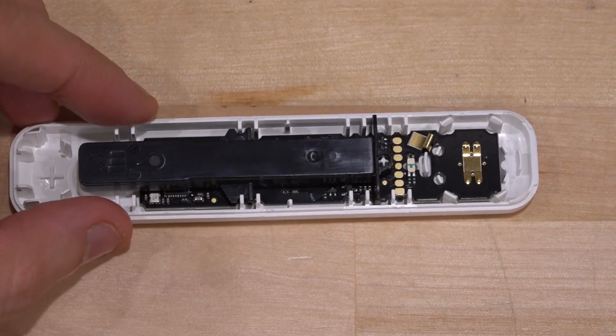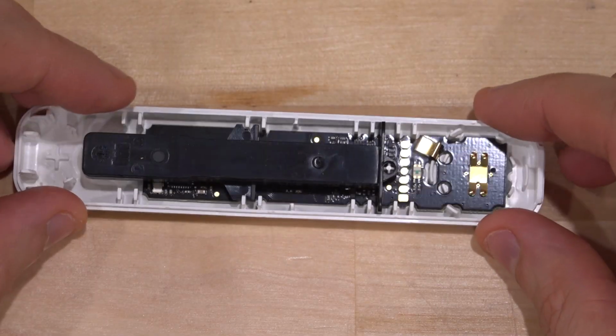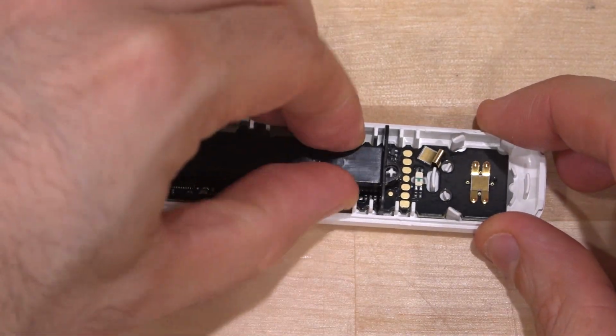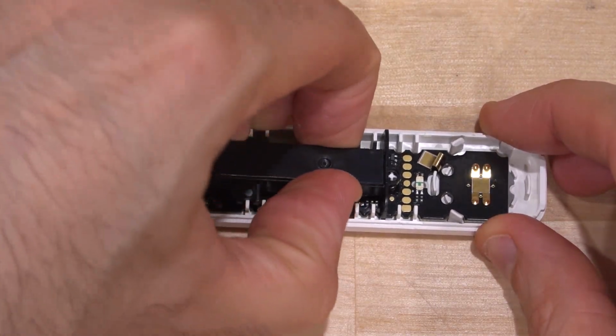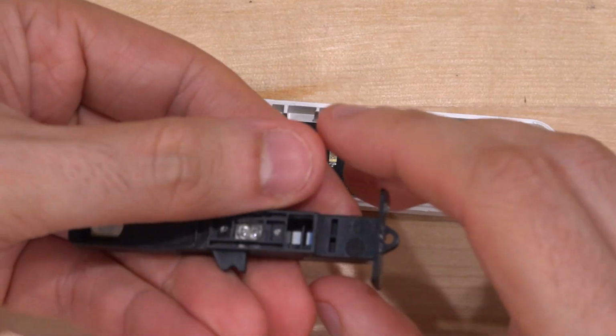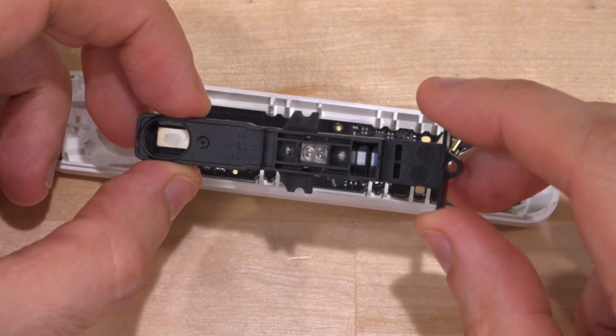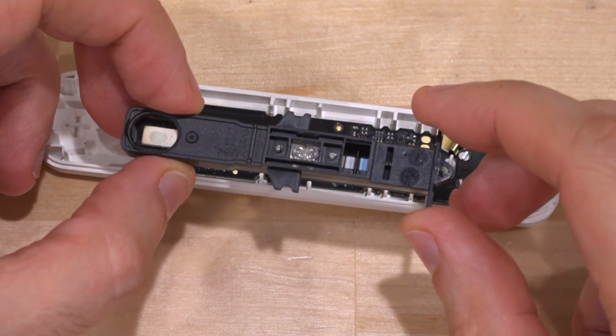We should be able to take this apart a little bit further. So this is obviously where the strip would probably be, and this must be coming separately. Yeah, there we go. That makes sense because they would assemble these afterwards. This is the part with the reagent. There we go. There it is. Look at that. Wow. There's actually a lot of optics in there. Fascinating. Yeah, we should take a closer look at this.